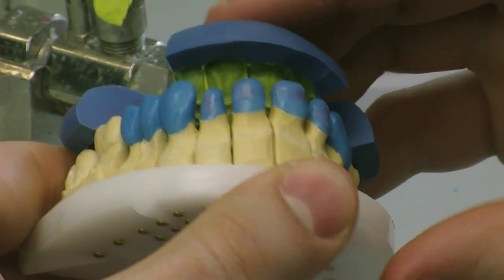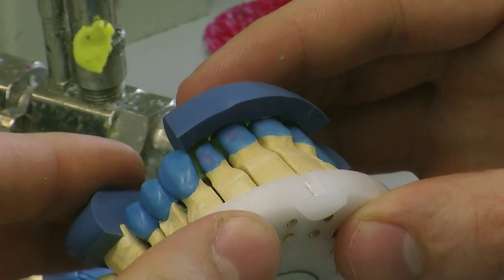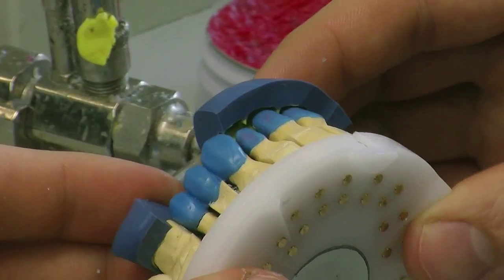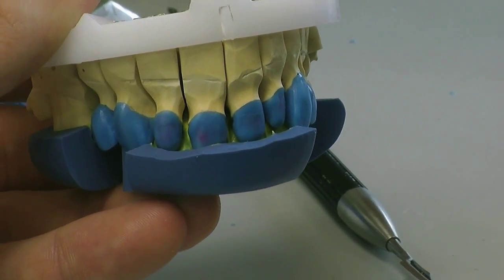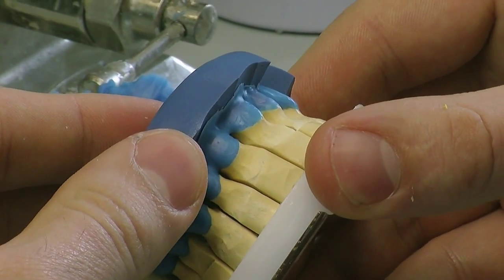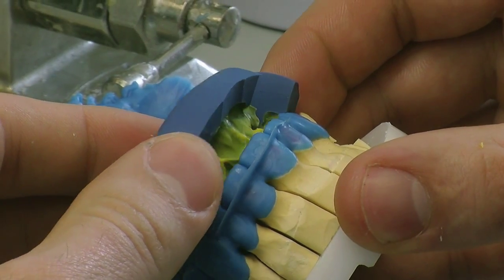What we're going to be doing now is going to be using this putty to establish our incisal edge position. This is a rigid fast putty which we like to use in the lab because it's extremely accurate, and we've used a light body to be washed with this case. So what we're going to do now is we're going to put the wax inside the putty and we're going to connect the incisal edge to our substructure copings. We're going to finish adding some wax to the front and gently tease the putty away from the wax so it doesn't destroy or damage it in any way.